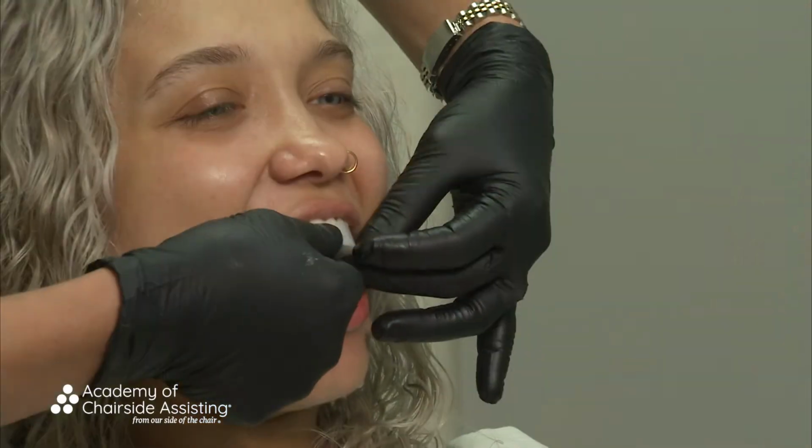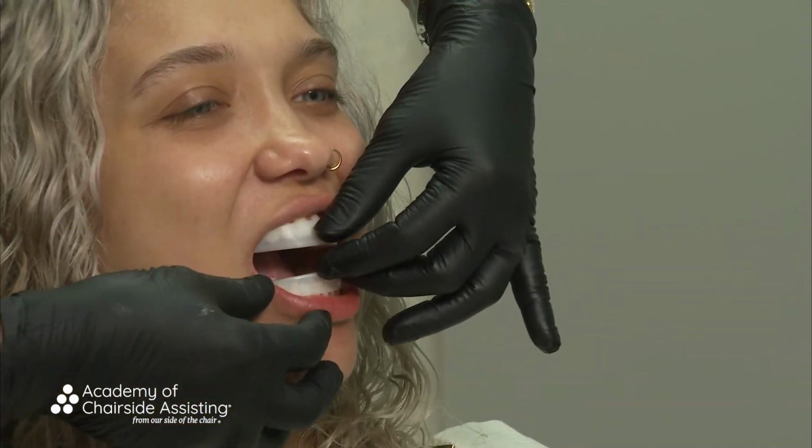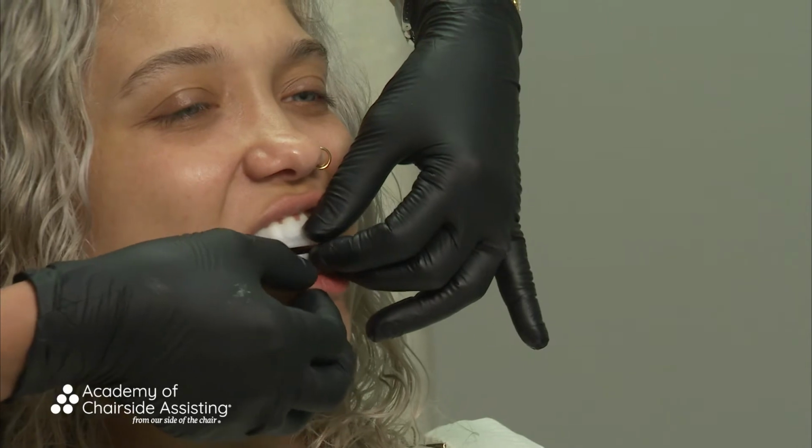The second thing is remembering that when I went through exactly how to place the tray, and most importantly, making sure that she doesn't pinch it too hard, because there is a lot of bleach, and you're going to see that when we show you the photos of what each tray looks like. Patients will pinch it too hard, and trust me, if they pinch it too hard, the hydrogen peroxide, very strong, is going to touch the gums and it's going to irritate it. What happens if that happens? Well, it's not like patients are going to say, gee, that feels good, I'm going to keep doing that. But what I do is I will have them make sure they dry their teeth really good, make sure things are really nice and dry.